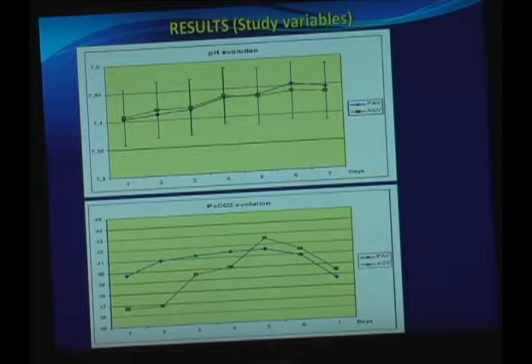Patients in control mode commonly develop a slight hyperventilation in the beginning, and at the end are comparable. So, from the physiological point of view, it seems that our approach was good to maintain normal blood gases as expected.